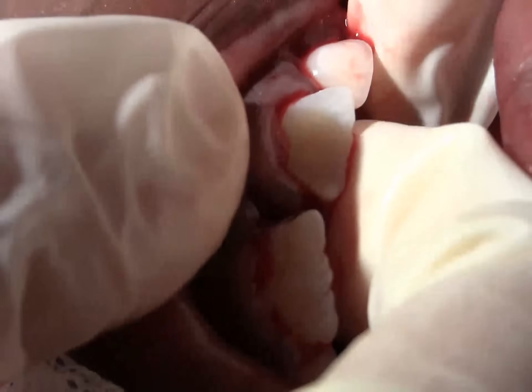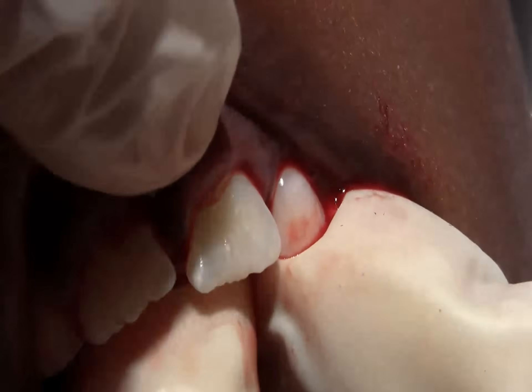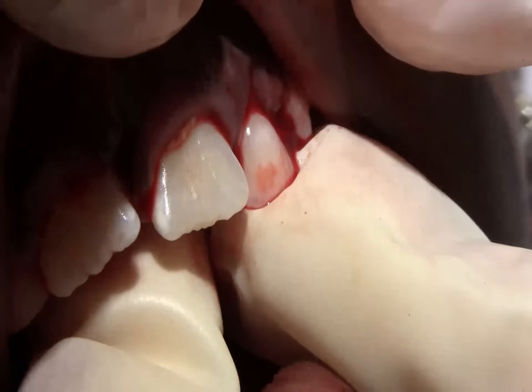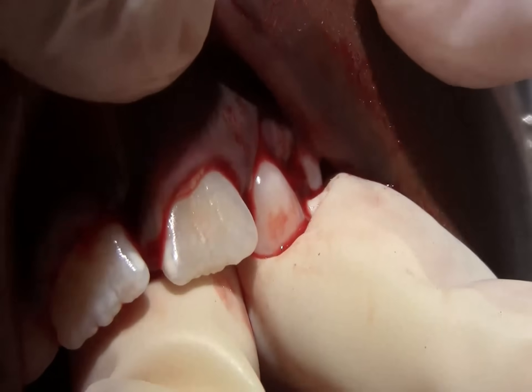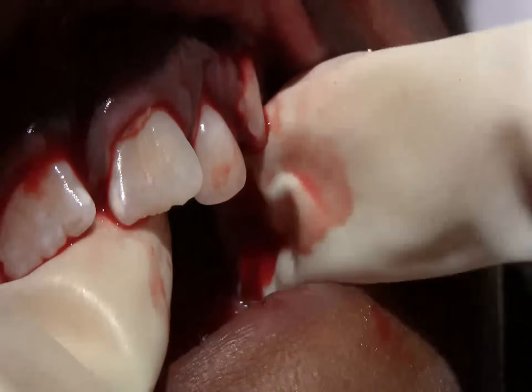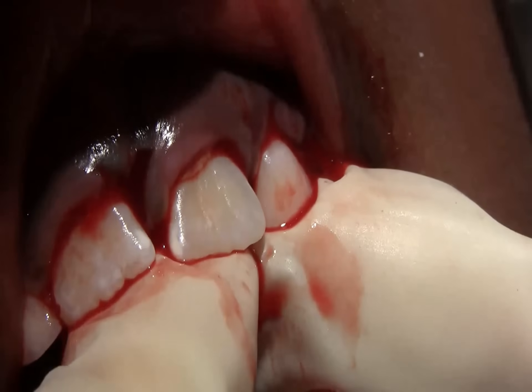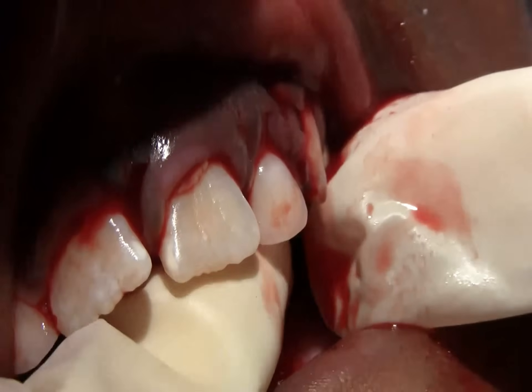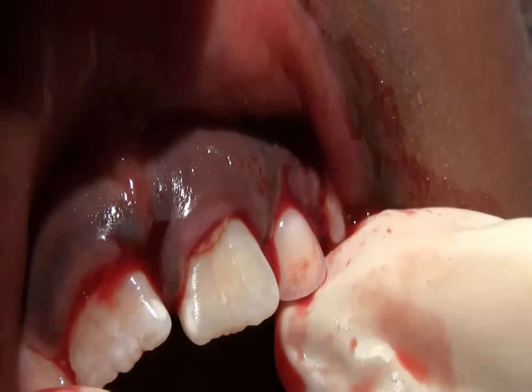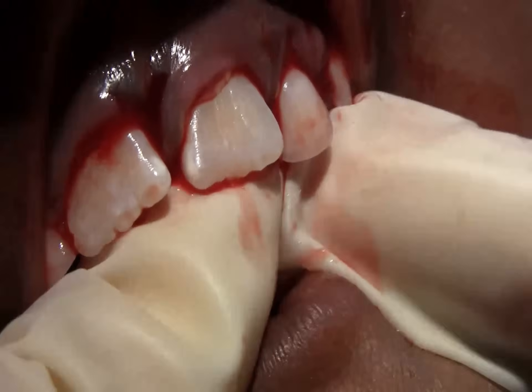I'm just putting your teeth. I got you. I'm just fixing them back where they were. Matt, can you see? Sure can. Okay, I'm trying to see if we can get them back into position. We want to try to push that hole.